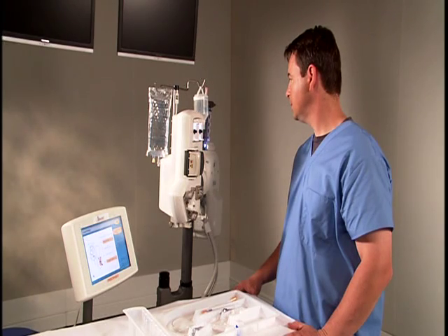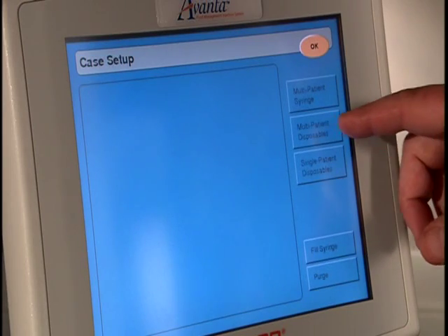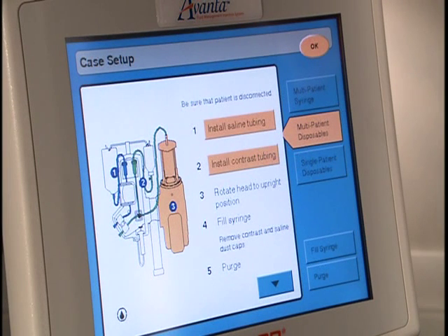To install a multi-patient disposable set, confirm that the syringe is in place and the plunger is at the end of the syringe. On the case setup screen, touch Multi-Patient Disposables. The DCU displays a graphic representation of the flow control module, contrast and saline containers, injector head, and multi-patient disposables. Note, the blue graphic represents saline, the green represents contrast.